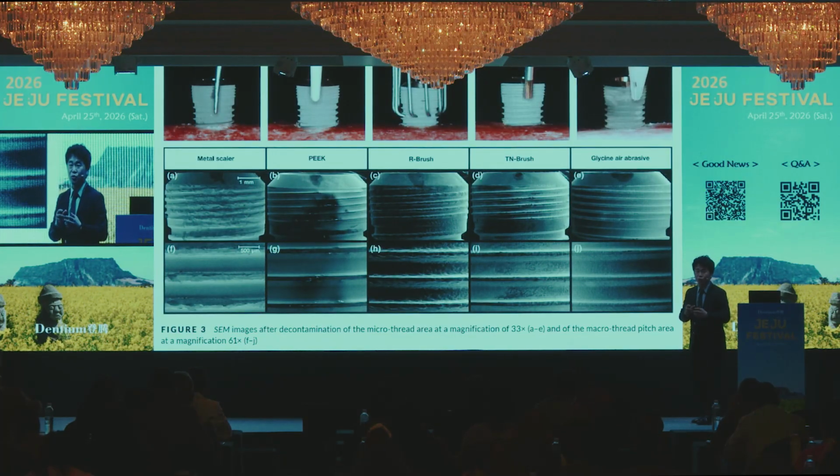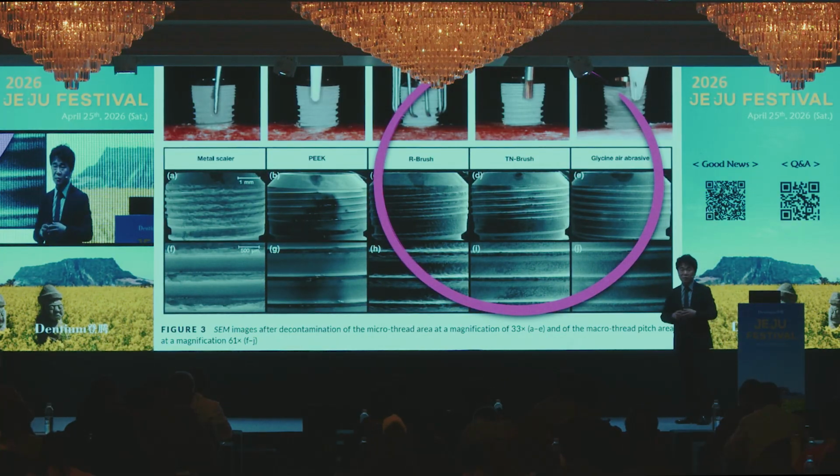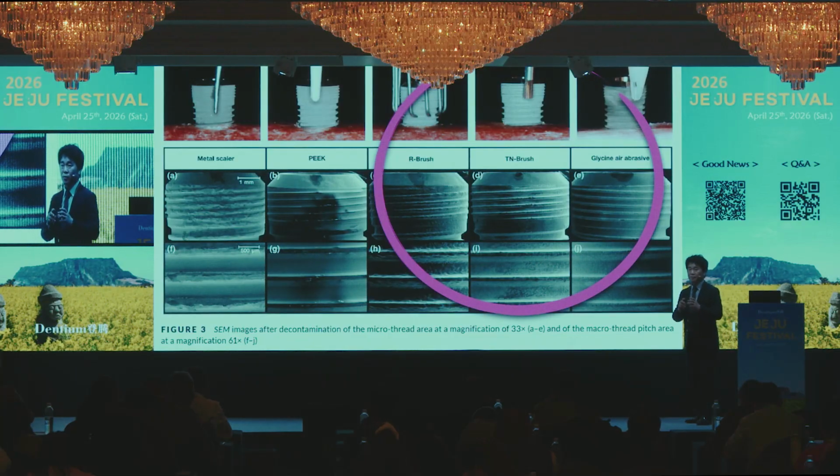So it is a good device to use before bone graft for peri-implantitis, I think. Scaler and PEEK devices are not good for regeneration.